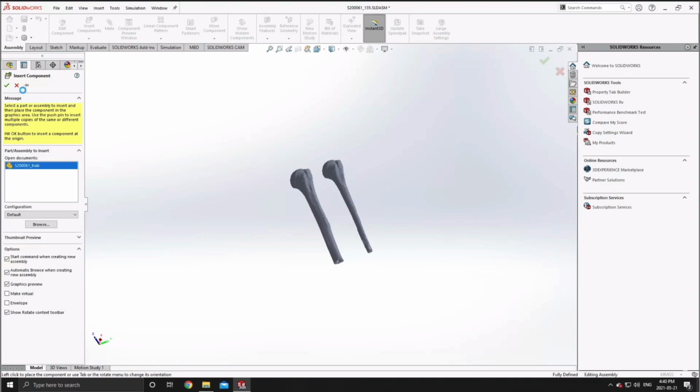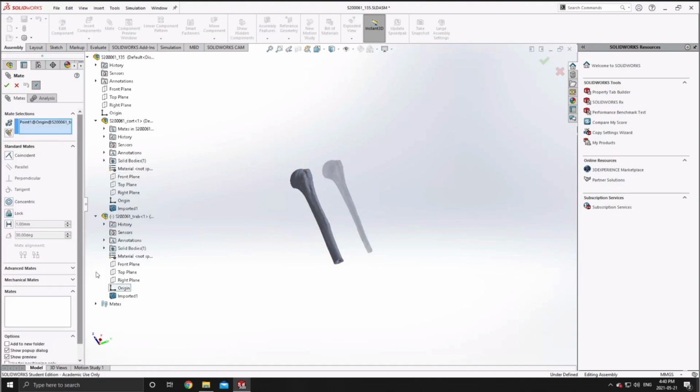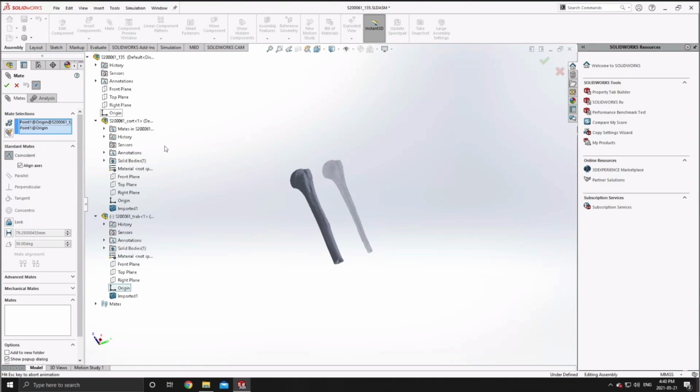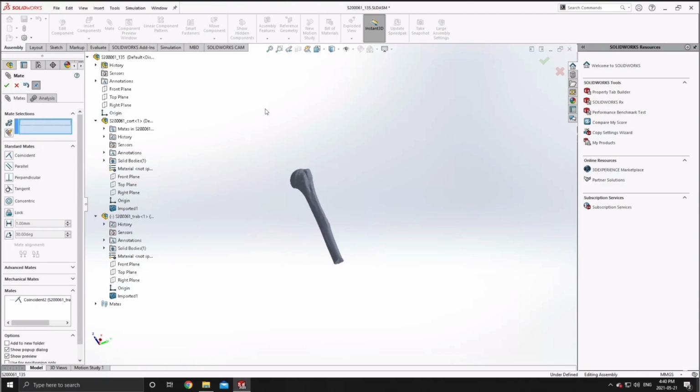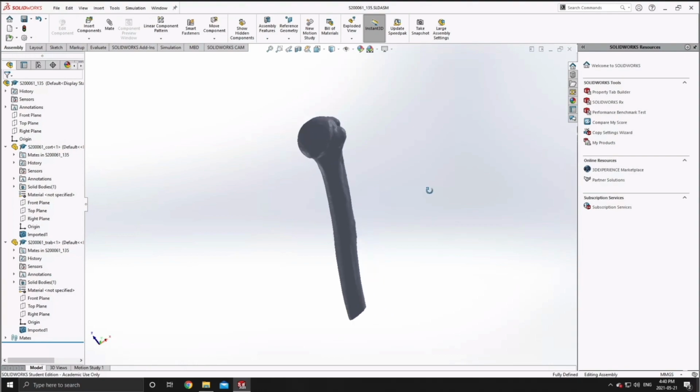Now, if we've done everything correctly up until this point, when you bring your trabecular bone model in, you'll easily be able to align the axes similarly to in the previous step, where you just mate it with the origin of the assembly itself, and it should auto-align the trabecular bone inside of the cortical shell, so there's no complex positioning that needs to go on after this step.